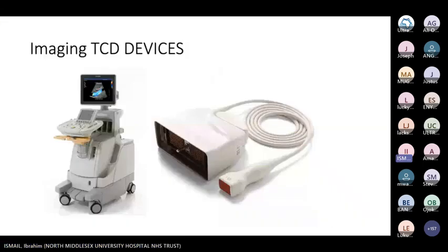Imaging is performed from the left and right temporal bones, using color Doppler flow imaging to visualize the vessels. A lot of our colleagues will have what I like to call a bad boy, the IU-22. It's a very robust ultrasound machine, and all you need is a phased array transducer capable of low frequencies between 1 to 2 megahertz.